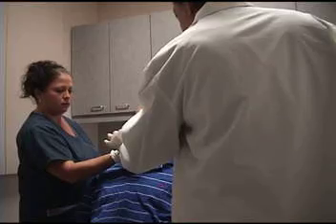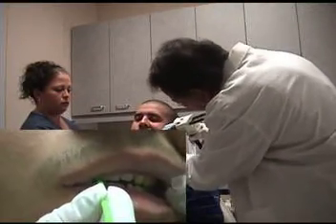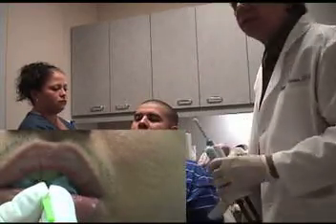Now I'm going to come to the other side now that that's set, and we'll take a look. And again, we will then inject over here, and you can see a slight change in that. There's a little bit of a cant change there.